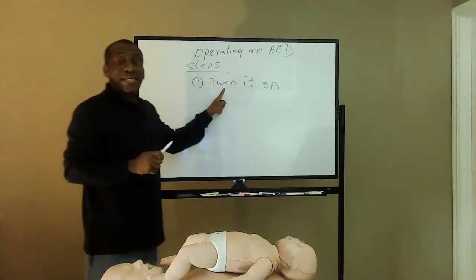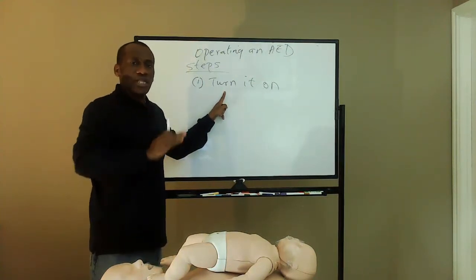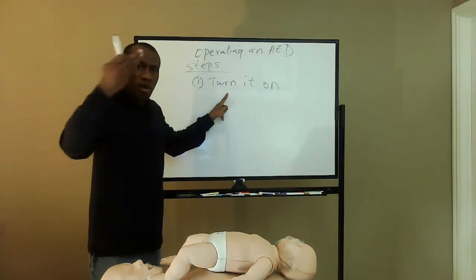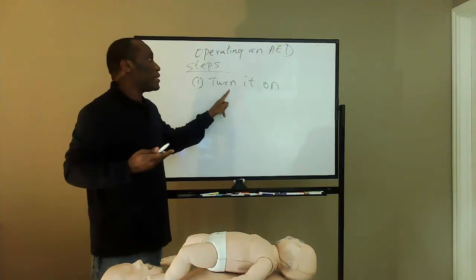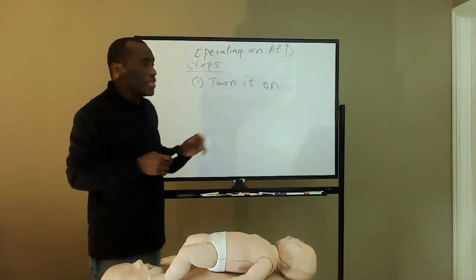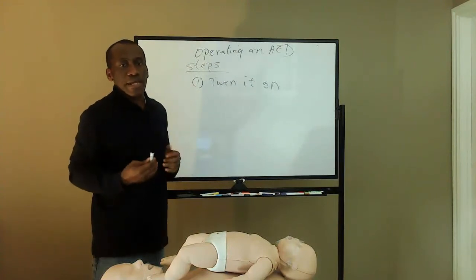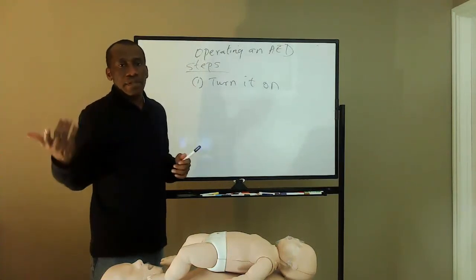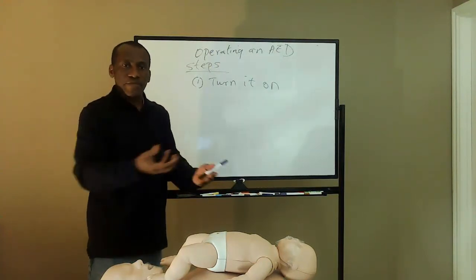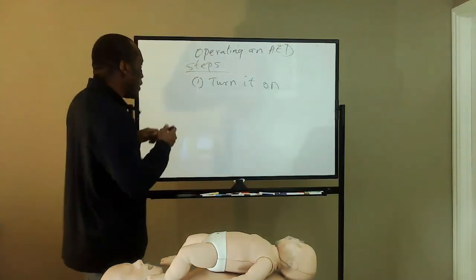Some AEDs can turn on automatically as soon as you lift the lid from the carrying case. But some may not be able to turn on automatically. So in that case, you have to turn it on by yourself, as soon as you bring it, lift the lid, or take it from the case. You have to power it on manually, and that is the very first thing.